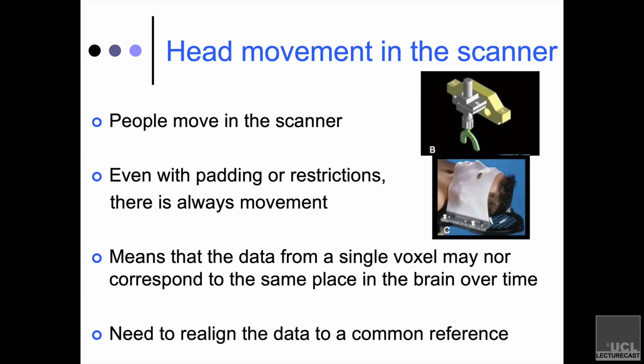And that's a much better approach, because even so, some people will move, but you're not forcing them into a position where they can't move and therefore making them extremely uncomfortable, perhaps exacerbating feelings of claustrophobia, etc. All you're doing is relying on the fact that they volunteered to be a part of this experiment. They're there volitionally, and they're trying to help as best they can. So you're taking that on board and giving them credit for it by just giving them simple reminders at a real tactile level from these soft pillows that their head won't move.